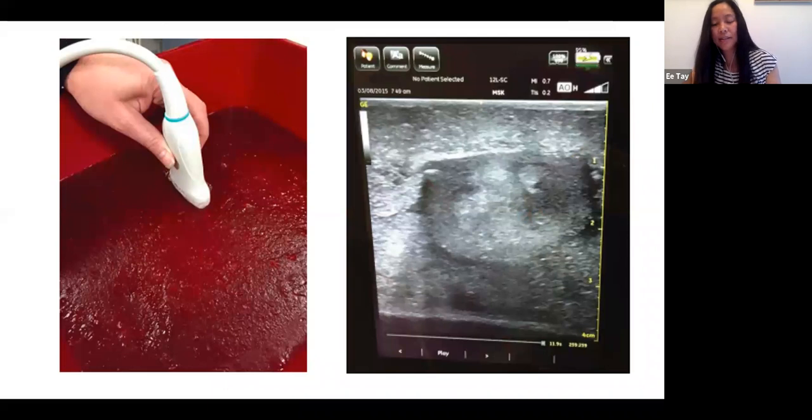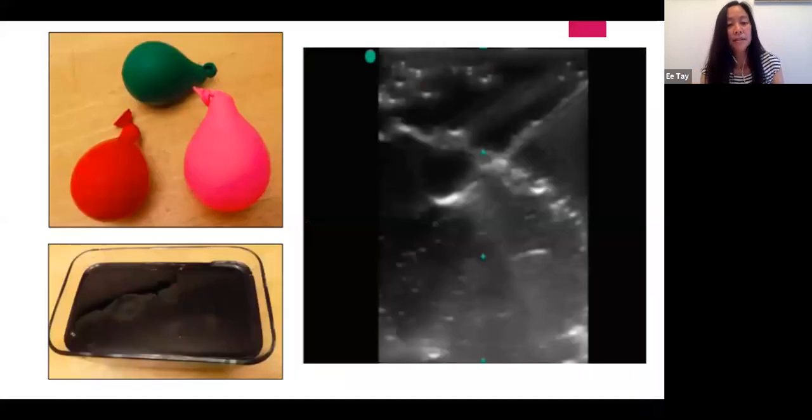I guess they really like the cherry flavor that matches with the cherry basin. And so they actually have this thing on the right side that looks like an abscess, and you can try to find it. And once you find it, the balloon is pretty pliable, so you can actually puncture it and simulate an abscess, an I&D, incision and drainage of some sort, with a needle. And so this is another type that you can see on the right side. It's an image of the needle actually going through the balloon when it's filled with substance, so that, again, you can mimic the I&D.